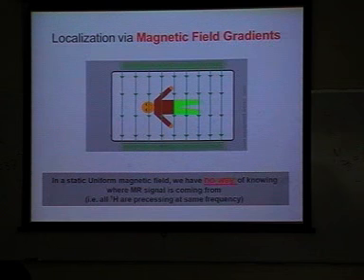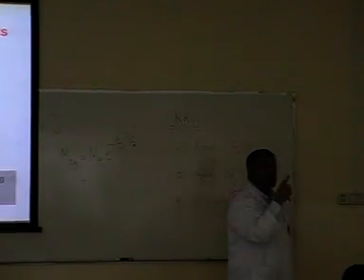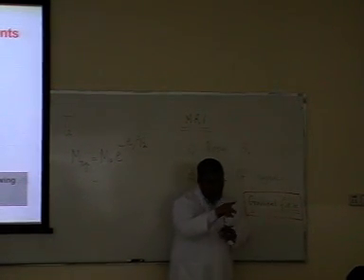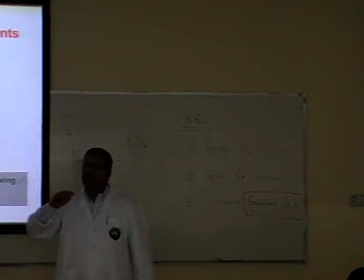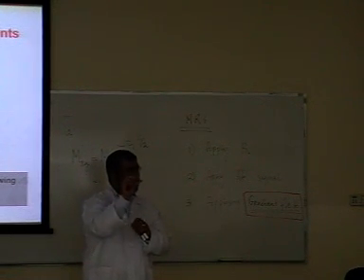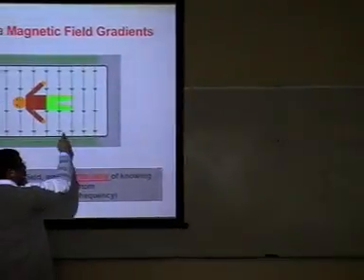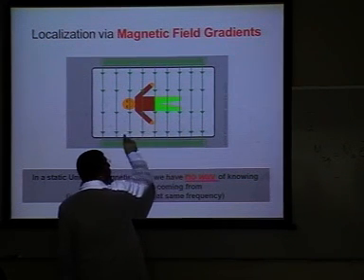Is it like putting a plate or a device on the... It's called a magnetic gradient. That's the gradient field. That's right. We'll see it in a minute. So the idea is to introduce a gradient. Do you know what the word gradient means? Gradient is when you add or subtract a small amount from the field. So instead of the field being static or uniform, say 1.2 Tesla, I introduce a gradient field, which means the field will not be uniform.